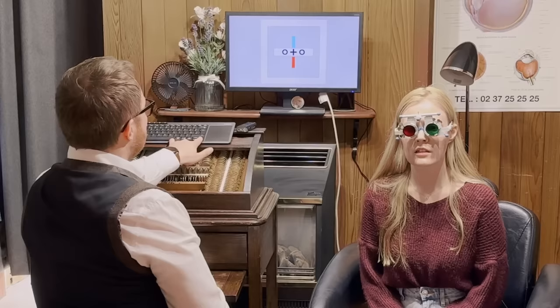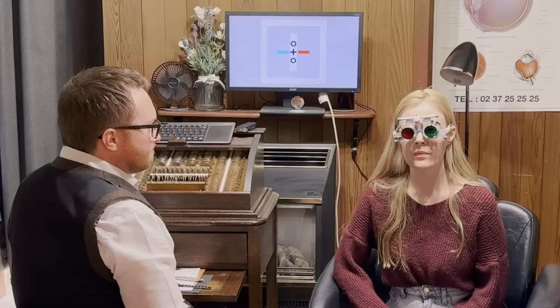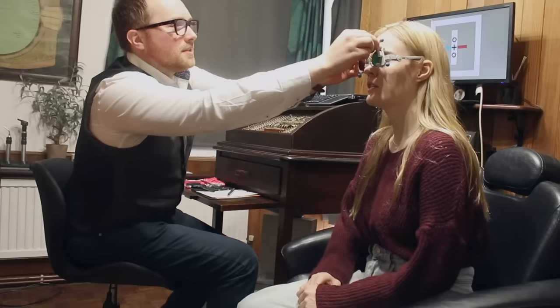Yep. Brilliant. And if I were to tip the chart over, and so they're now side by side, can you still see the blocks there? Yes. Yeah. And is one of them higher than the other, or are they about the same? I think they're the same, just the red slightly more clear this time than the last one. Okay. Let's get rid of those coloured lenses. Okay.